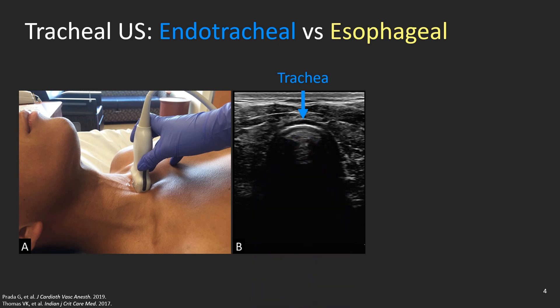Now, what do you think happens when you insert a tube inside this trachea? Nothing. Nothing happens. The image does not change at all. Endotracheal intubation looks exactly the same as no intubation at all. You still get the single comet tail artifact. You cannot see the tube inside the trachea because the air inside the trachea prevents you from seeing what's inside, including the tube. Remember that air is the worst enemy of ultrasound.